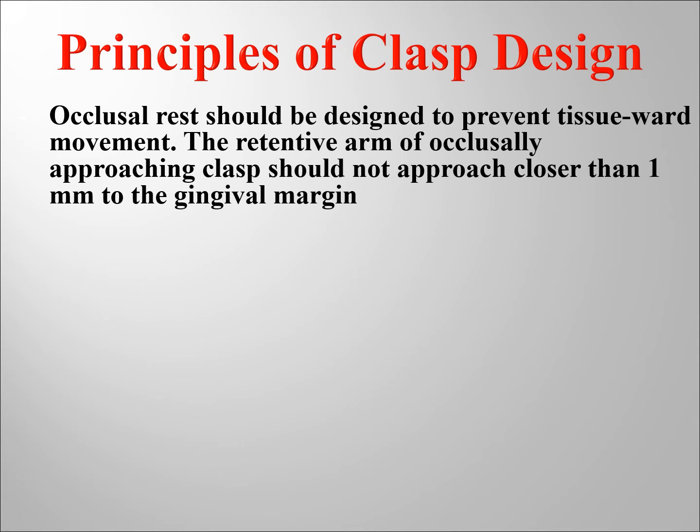So we provide not just an occlusal, a rest. A rest in the clasp assembly will prevent tissue-wards movement of the clasp assembly. It keeps it in its place, it provides retention, and also it prevents irritation to the gingiva from the retentive arm.